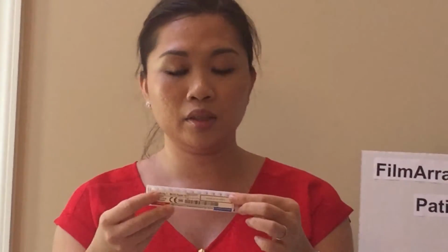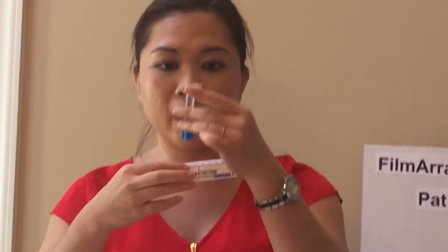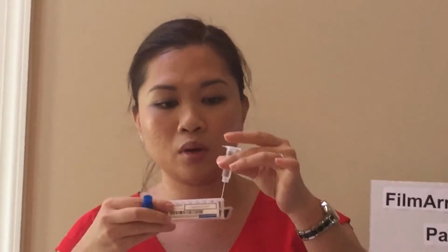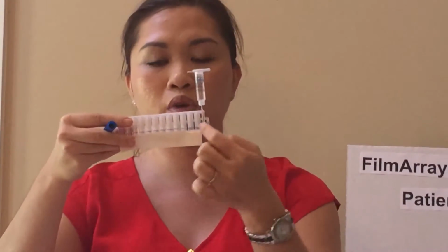which has two parts. This is the red part and this is the blue part. The red part is for the sample mix and the blue part is the hydration. You can also put the patient ID here. So on the blue part, which is the hydration pouch, we have the hydration vial. What you need to do is twist it, push it into the well, push it down, so the fluid will flow into the pouch.